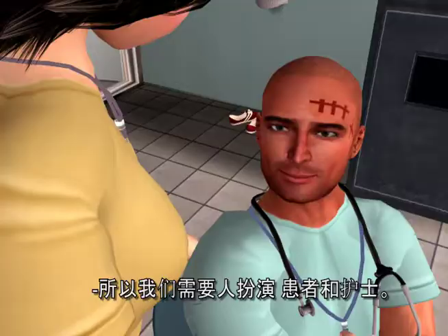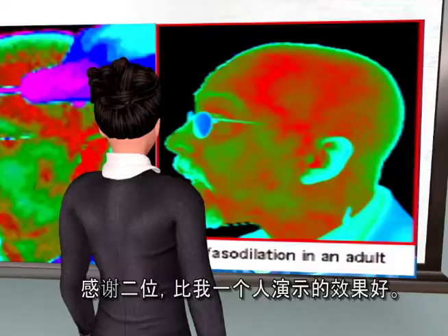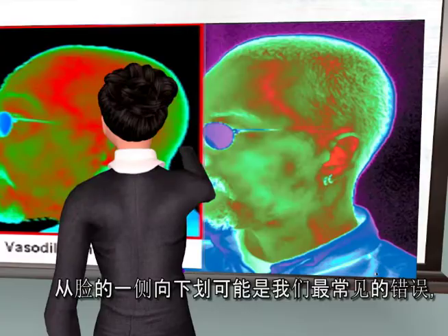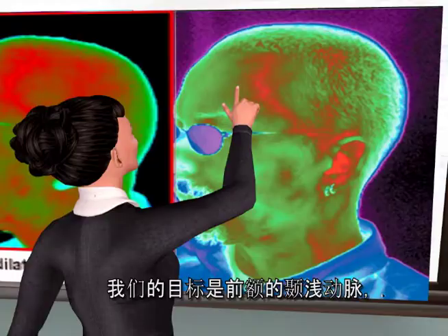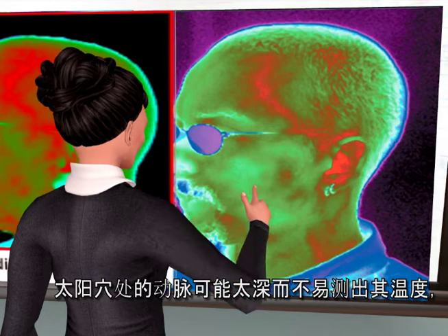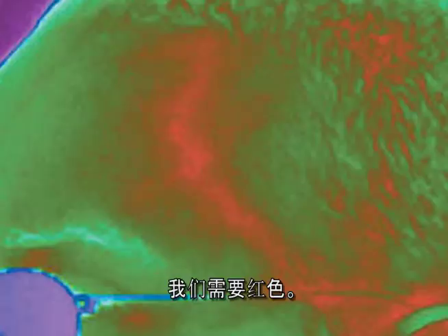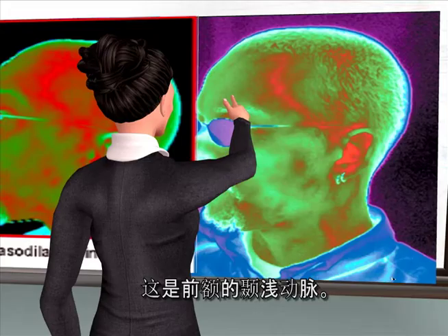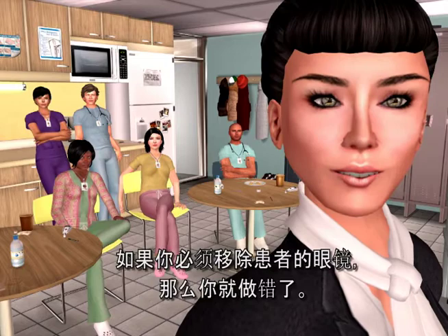It certainly looks like we have our patient and our nurse educator — thank you both. Curving down the side of the face is probably the most common error we see, so don't feel badly. Our target is the superficial temporal artery at the forehead, not at the temple. At the temple, the artery can be too deep to register, or you might just miss it entirely. A quick rule of thumb: if you have to remove your patient's glasses, you've done it wrong.